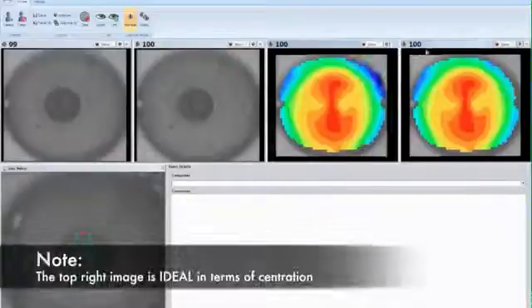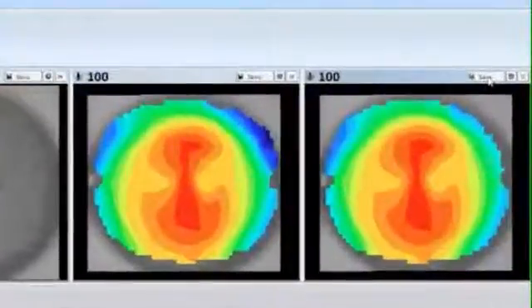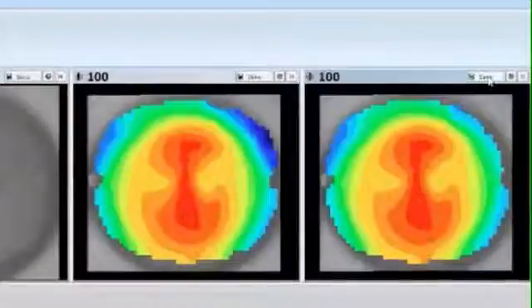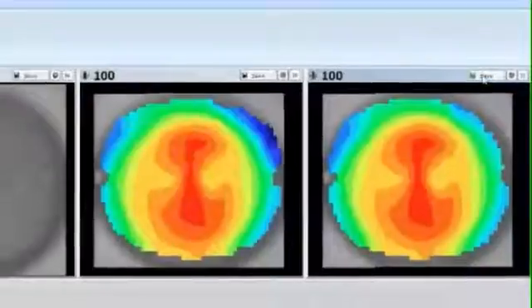It is important to note that the capture percentage in the top right-hand corner of the screen is not indicative of data quality captured. This is a measure of the machine's accuracy when capturing.